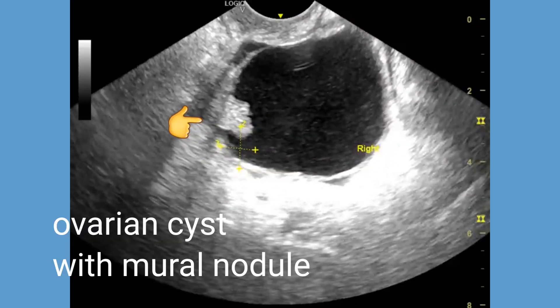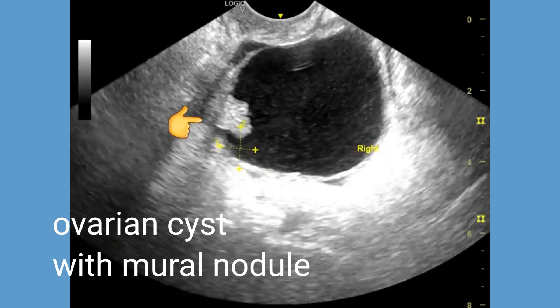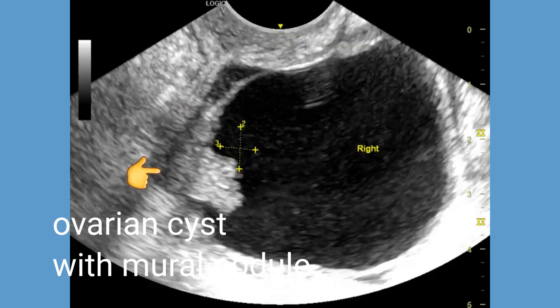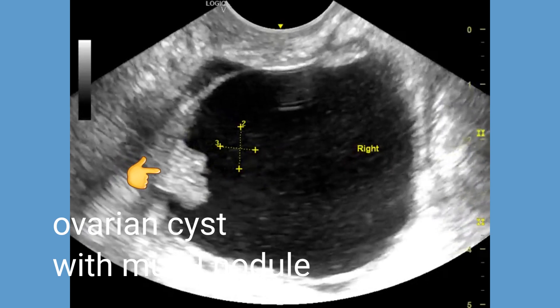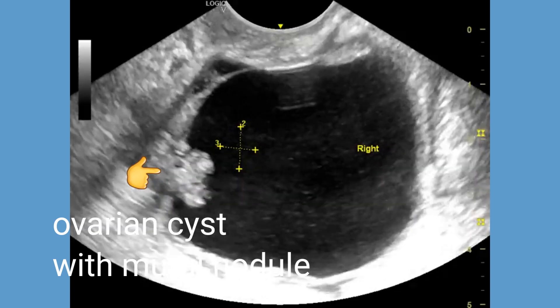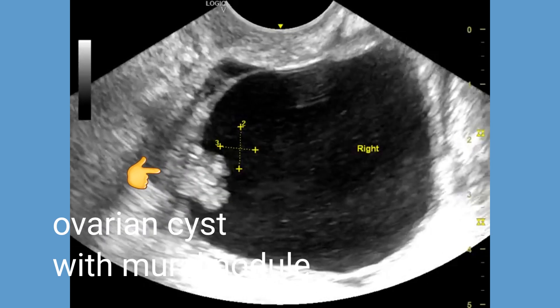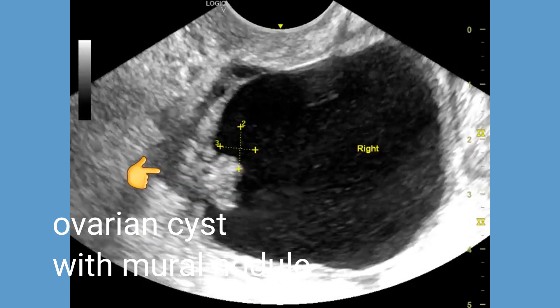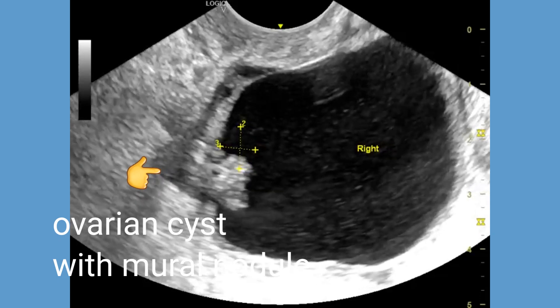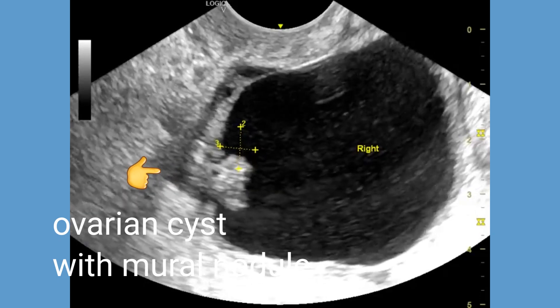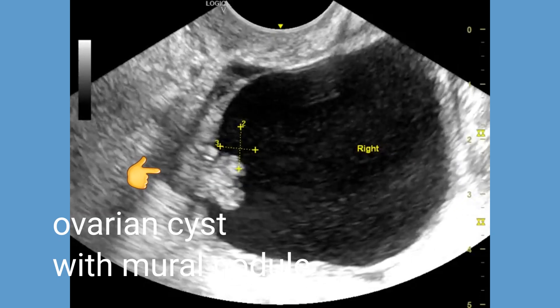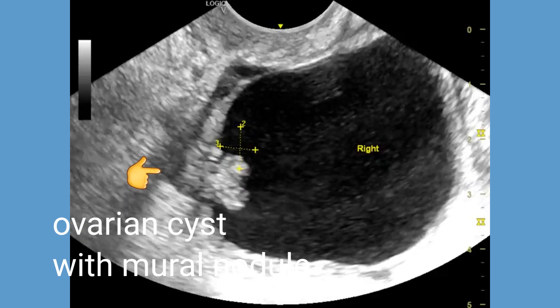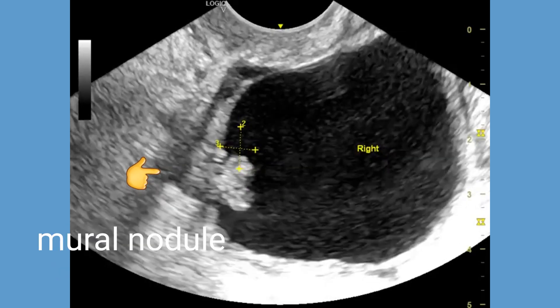This video shows an ultrasound examination of a middle-aged female who presented with pelvic pain and irregular menstrual bleeding. The right ovary is enlarged and shows a 4 cm cystic mass with a 0.9 cm mural nodule.